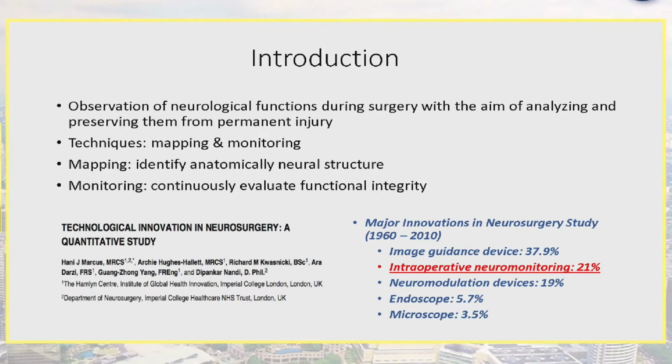While monitoring continuously evaluates the functional integrity. So with any immediate feedback that we have about warning signs or abnormalities, we can proceed with immediate intervention. This does provide improved post-operative neurological outcome.